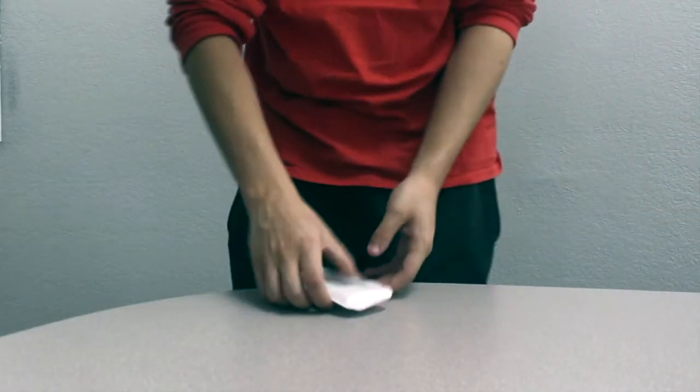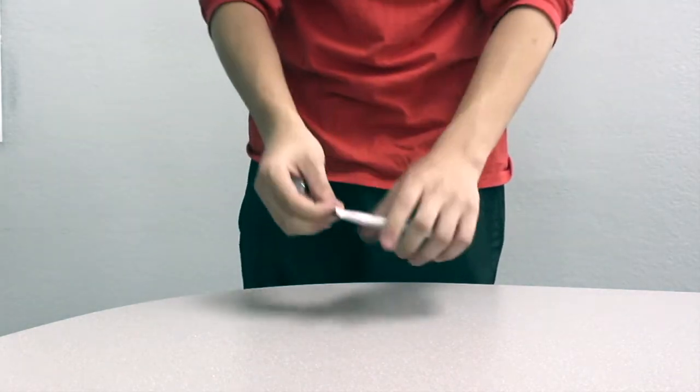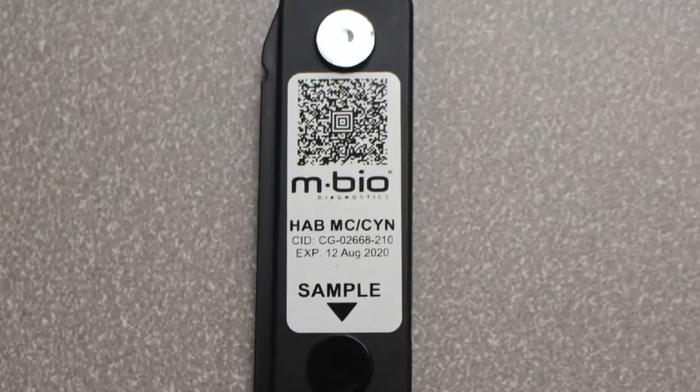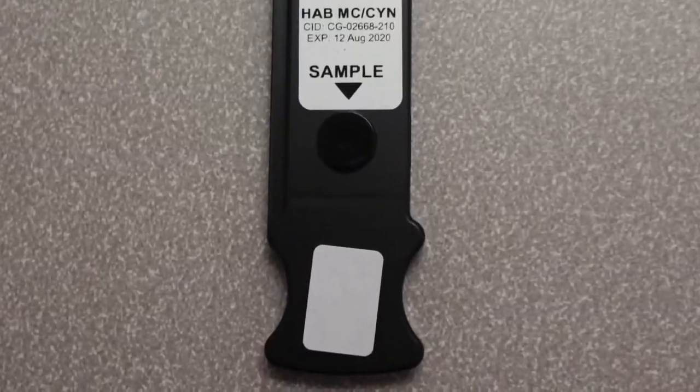Now that we are ready to begin our procedure, grab your cartridge bag and open it using the provided pull tabs. Empty the contents, which should include the cartridge, the reagent tube, and a desiccant. Each cartridge will have an associated barcode, cartridge ID number, and a blank space for you to write on.